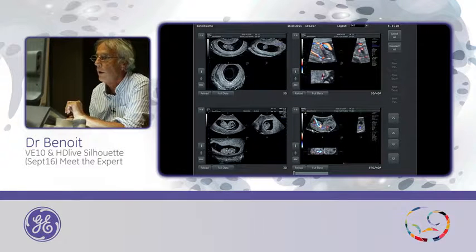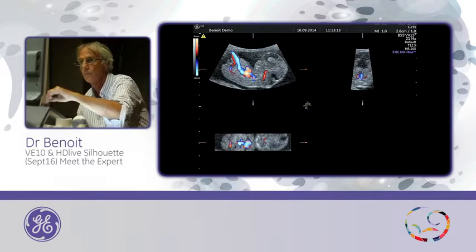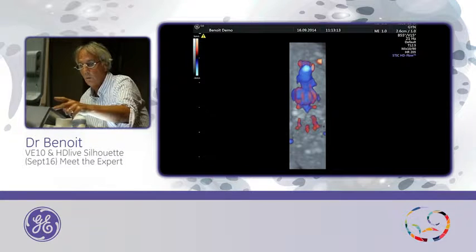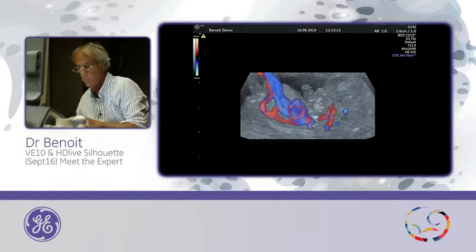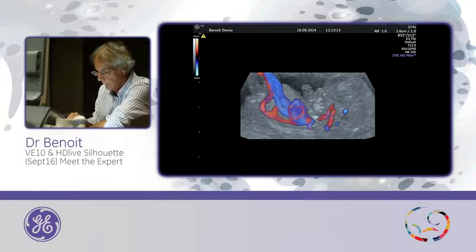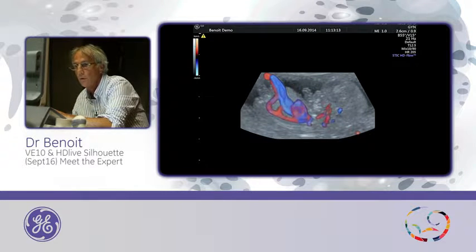And for this embryo, I did also this. This was a STIC acquisition with a color Doppler. So I change the position of the region of interest. So I have to go main, sub, this one. Because it was a STIC, I can activate and start movement, reduce the size.